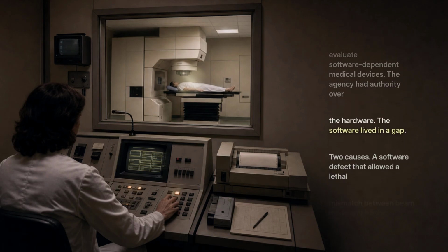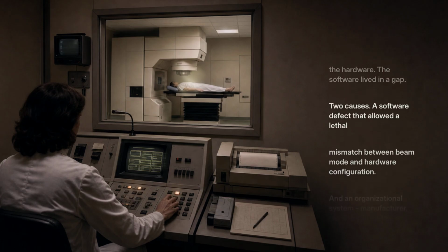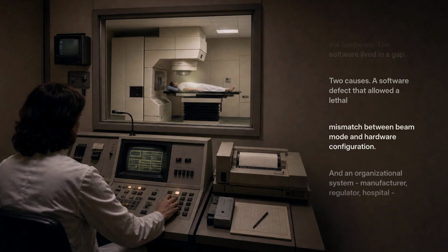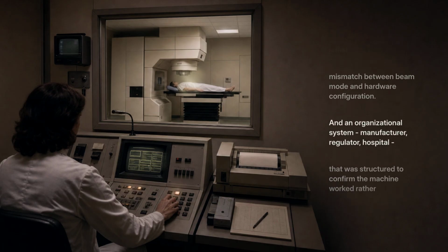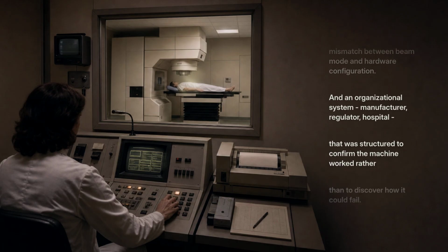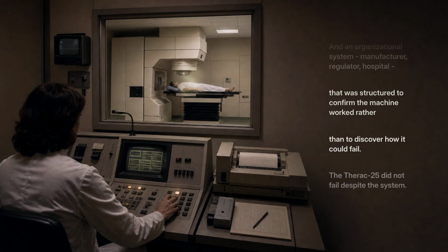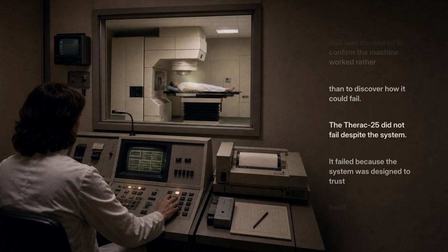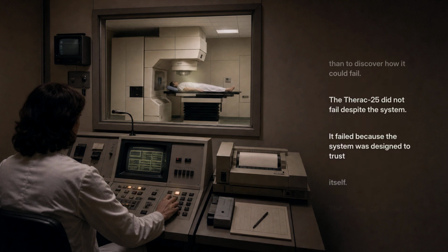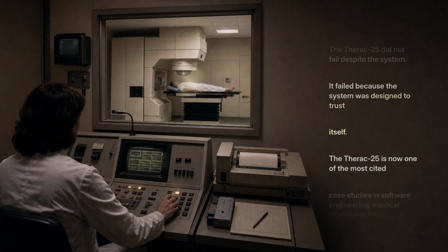Two causes: a software defect that allowed a lethal mismatch between beam mode and hardware configuration, and an organizational system, manufacturer, regulator, hospital, that was structured to confirm the machine worked rather than to discover how it could fail. The Therac-25 did not fail despite the system. It failed because the system was designed to trust itself.